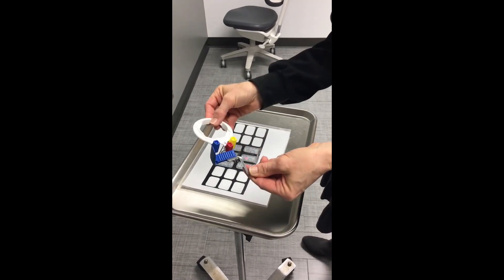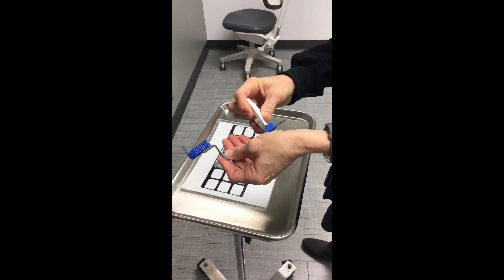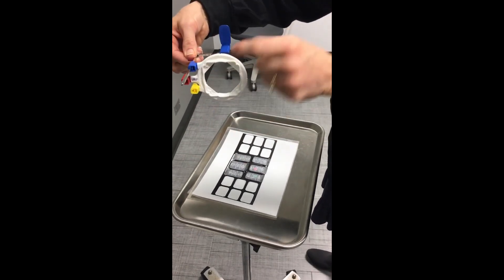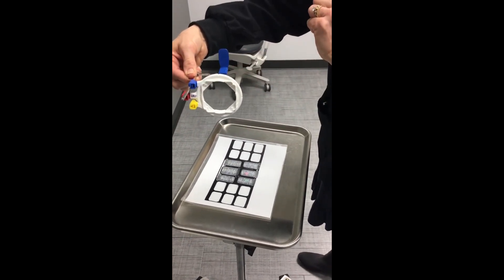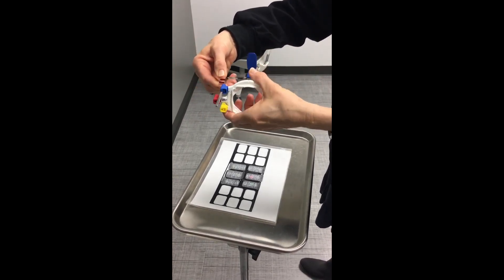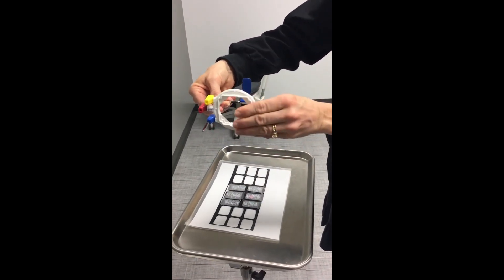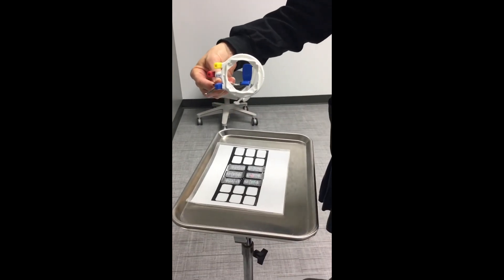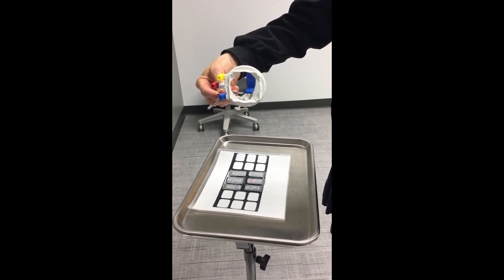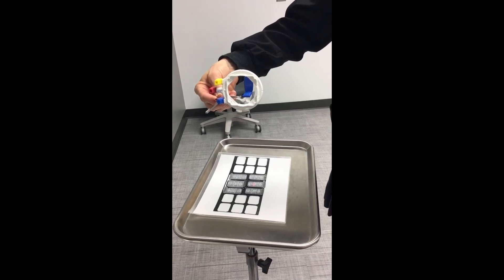Then put your ring on. When the ring is on correctly, you should be able to look through the ring and see the entire bite block. I'll show you incorrect first — as you can see, that would not be correct. You want to change your ring until you can see the entire bite block through the ring. That will allow you to get a correct projection without a cone cut.